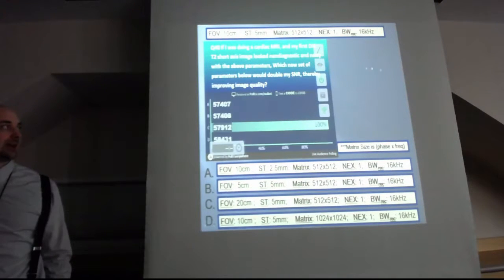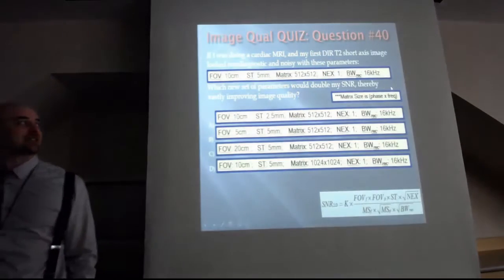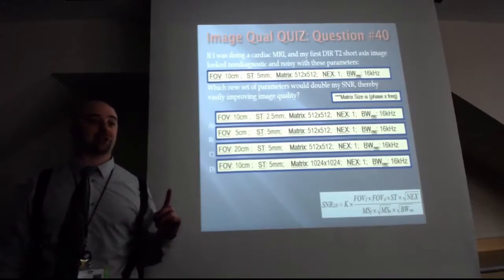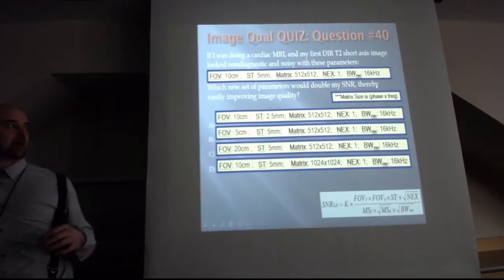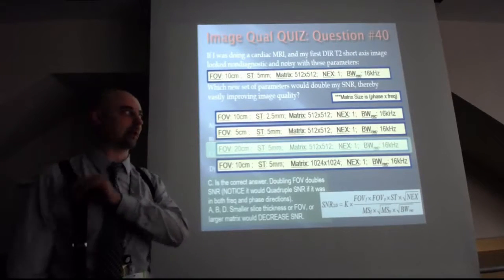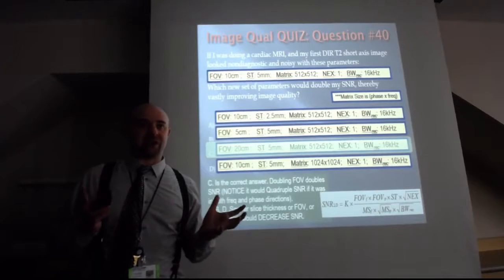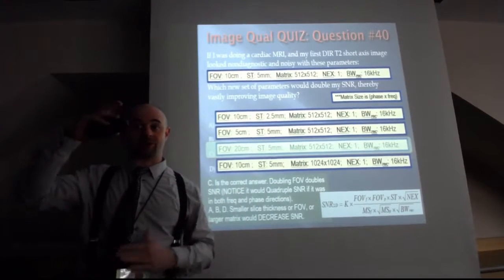All right, you guys are dead on today. So yes, field of view. Now some of you may have thought that the correct answer was not showing, or that it was kind of a bad question, and you're right. I have intentionally made some of these questions more like test questions, in that they can be bad or misleading. So really, if you double the field of view, and I don't specify whether that's the phase field of view or the frequency field of view, you kind of assume that it's square.